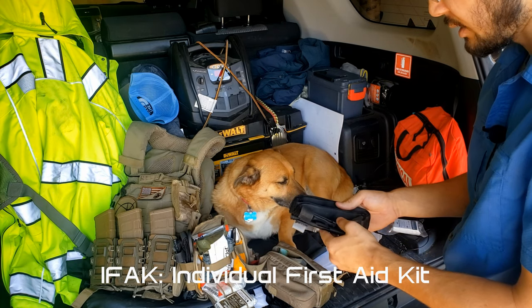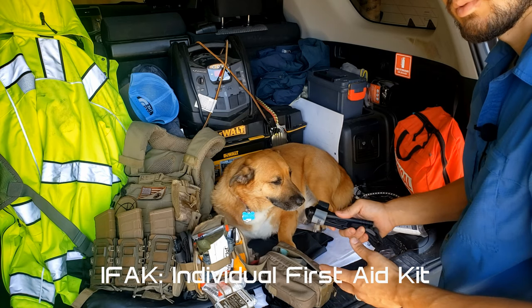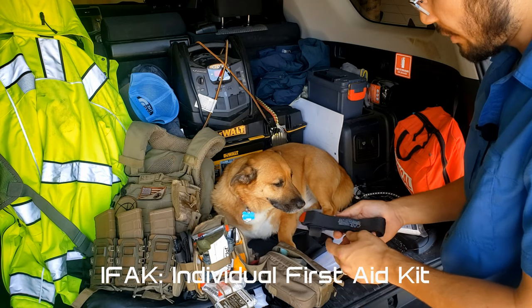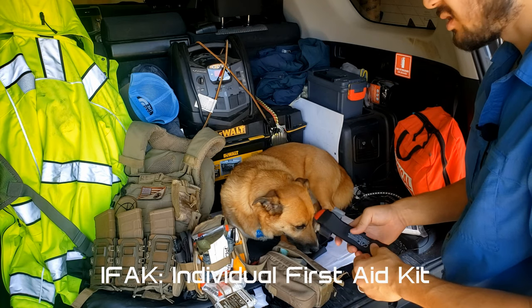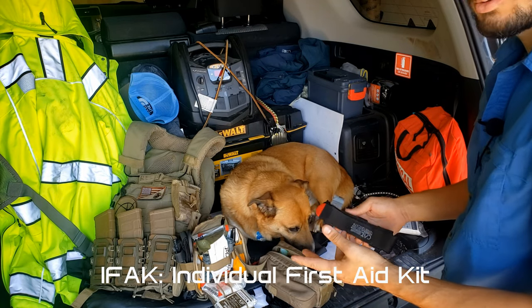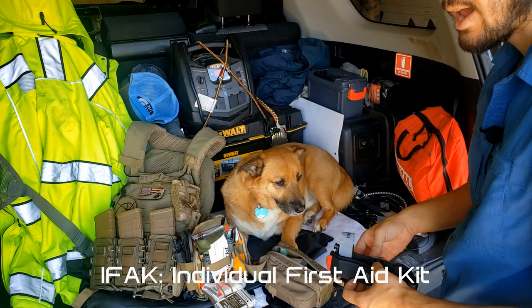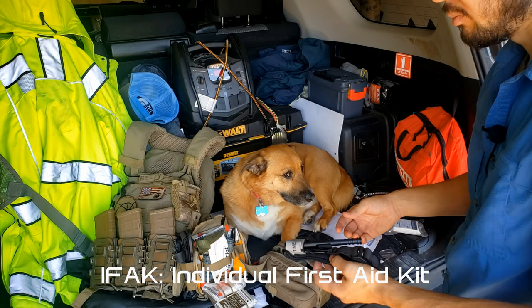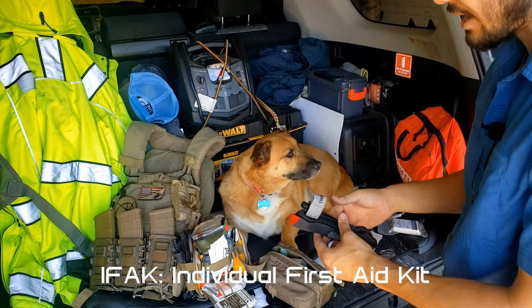So number one, make sure you're not getting a counterfeit. Do not buy these off of Amazon. So many sellers are selling counterfeits. I buy mine from North American Rescue. Chinook Medical is a good one. There's a couple other ones too, but really, if you stick with those two, you'll be fine. They should cost about $30 apiece. If they're 10 or 15, for example, they're probably fake. And there's some good videos on there on how to spot a fake CAT tourniquet.